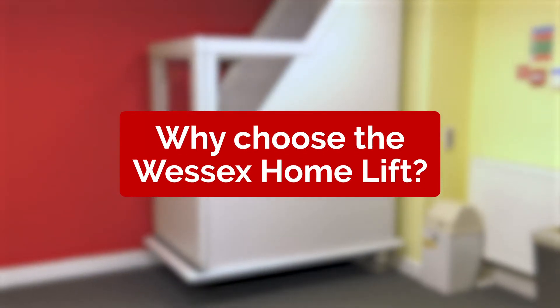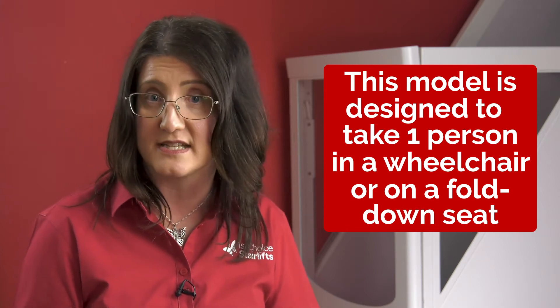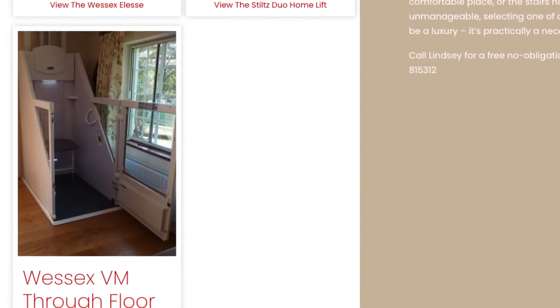Why choose the Wessex home lift? The VM home lift is super reliable and has many different platform size options to accommodate your needs. It is designed to take one person in their wheelchair, or one person seated on a fold-down seat, and for safety reasons this is a seated model only. The great thing about the VM model is that it can hold up to 250 kilograms — that's just over 39 stone.